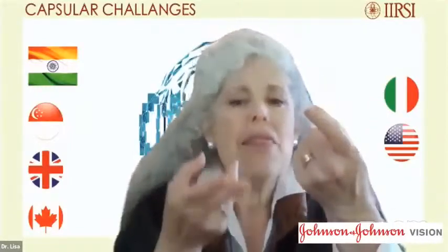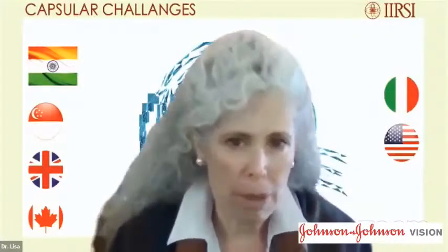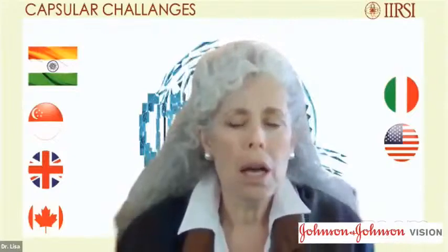with a little OVD between the iris and the anterior capsule, particularly in a myopic patient, go in under OVD control on foot position zero, lift the iris, and then go to foot position one. Then you'll never get that retropulsion of the iris that occurs with reverse pupillary block in the myope or the patient with poor zonules. And so you can assure that you don't over deepen the chamber, which will easily happen. And that's the end of the case already on a myope or someone with very lax zonules. So it's just one little detail.